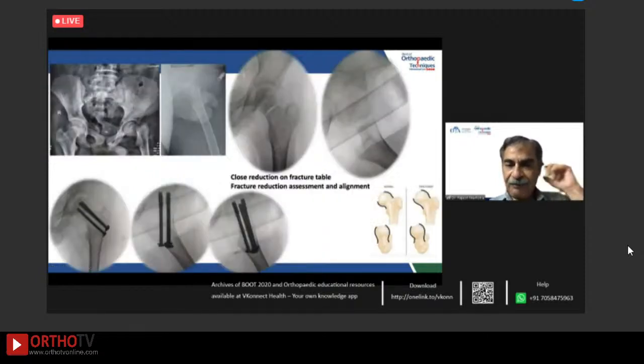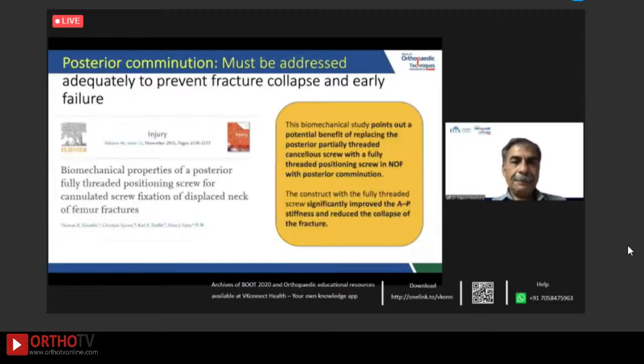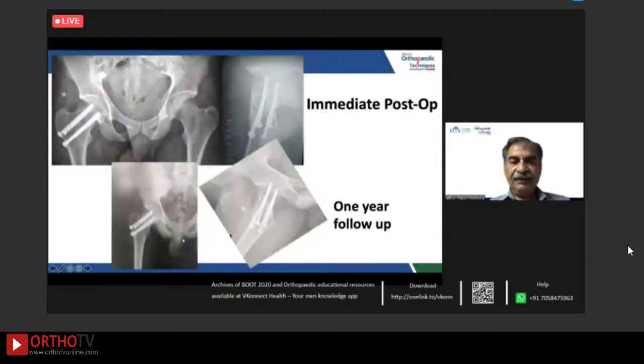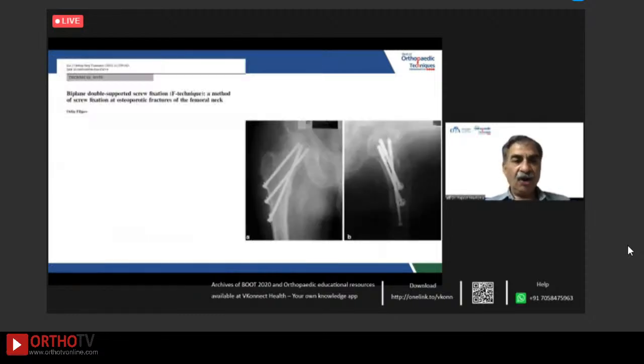This is an example of the closed reduction, the assessment and the fixation. The posterior comminution must be addressed. So if you have a posterior comminution, you must put a fully threaded positioning screw posteriorly to support the posterior comminution. This is an example where the posterior comminution was addressed with two posterior screws, 7 millimeter fully threaded. And this has gone on to union with 1 year follow-up.